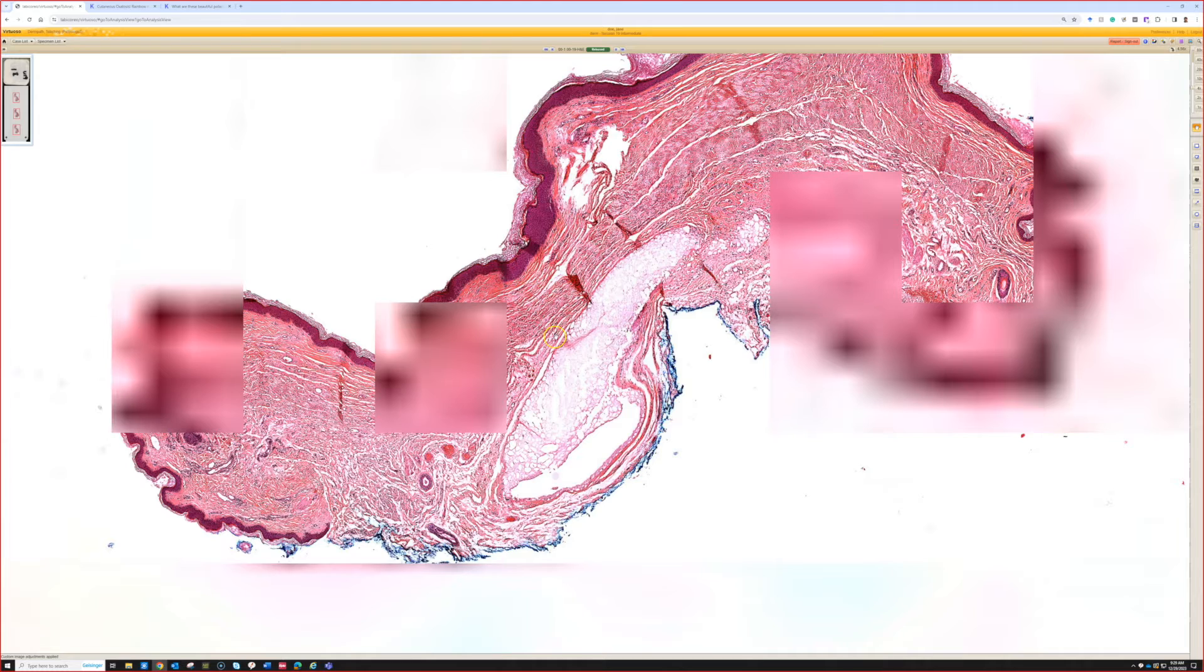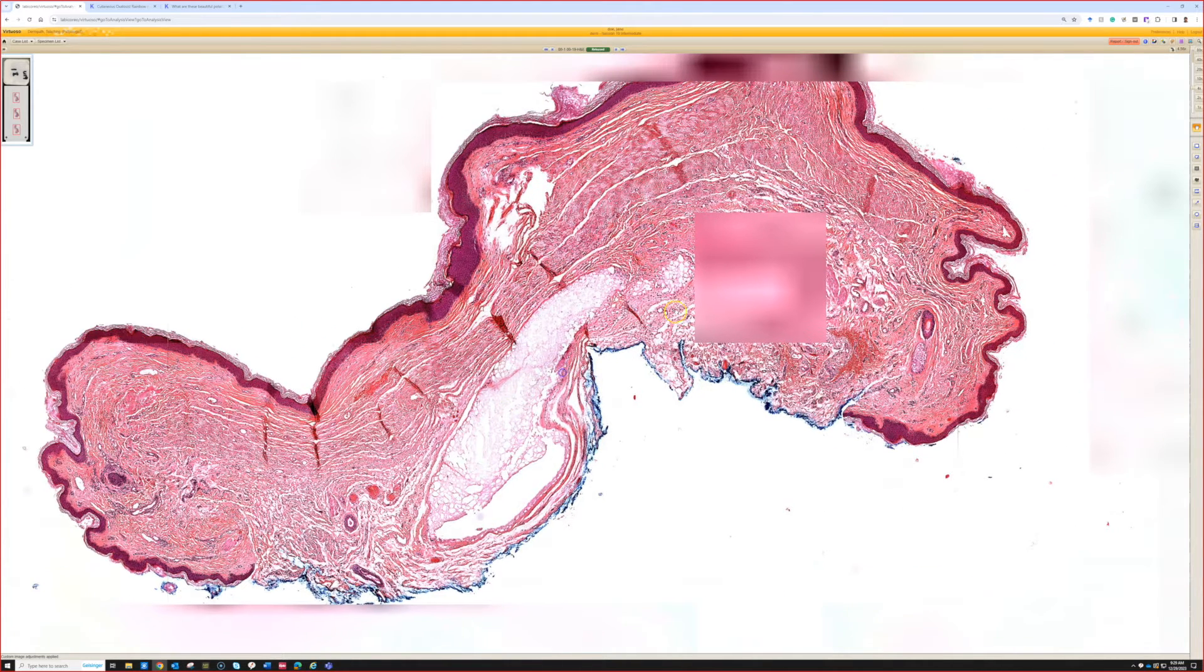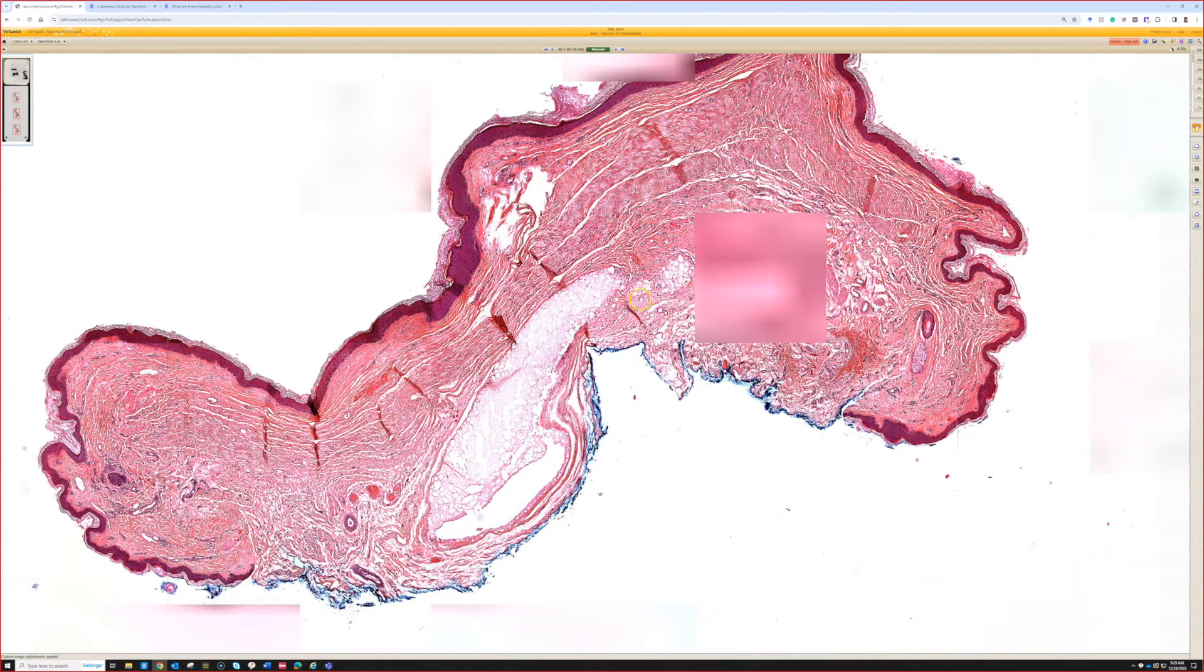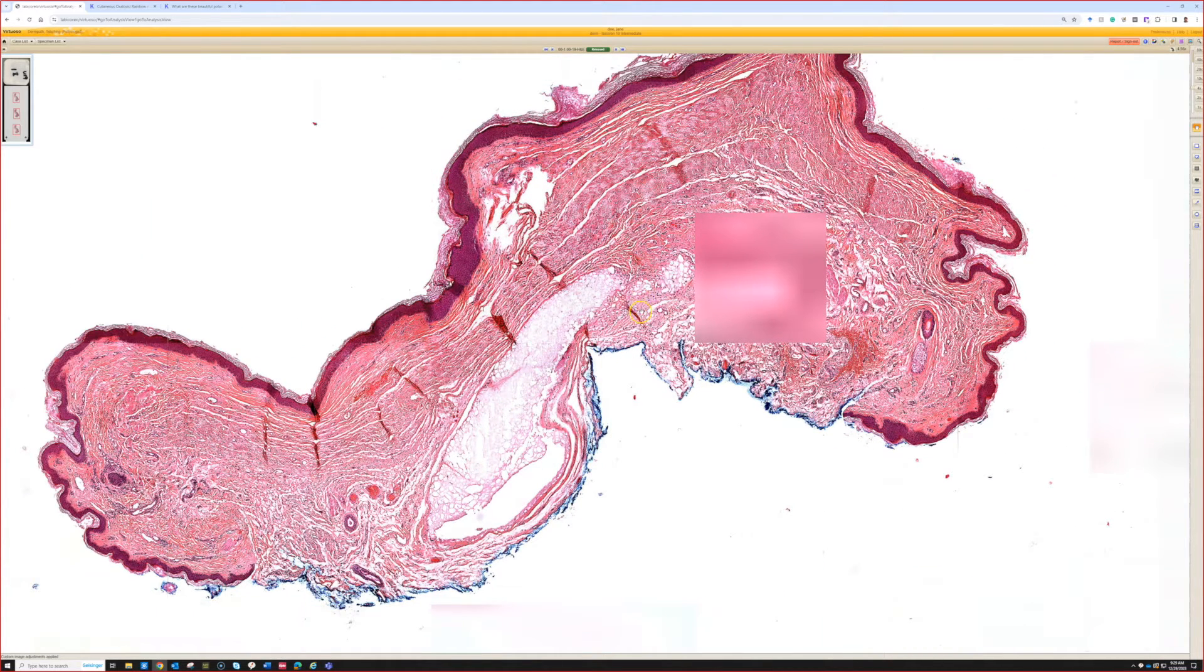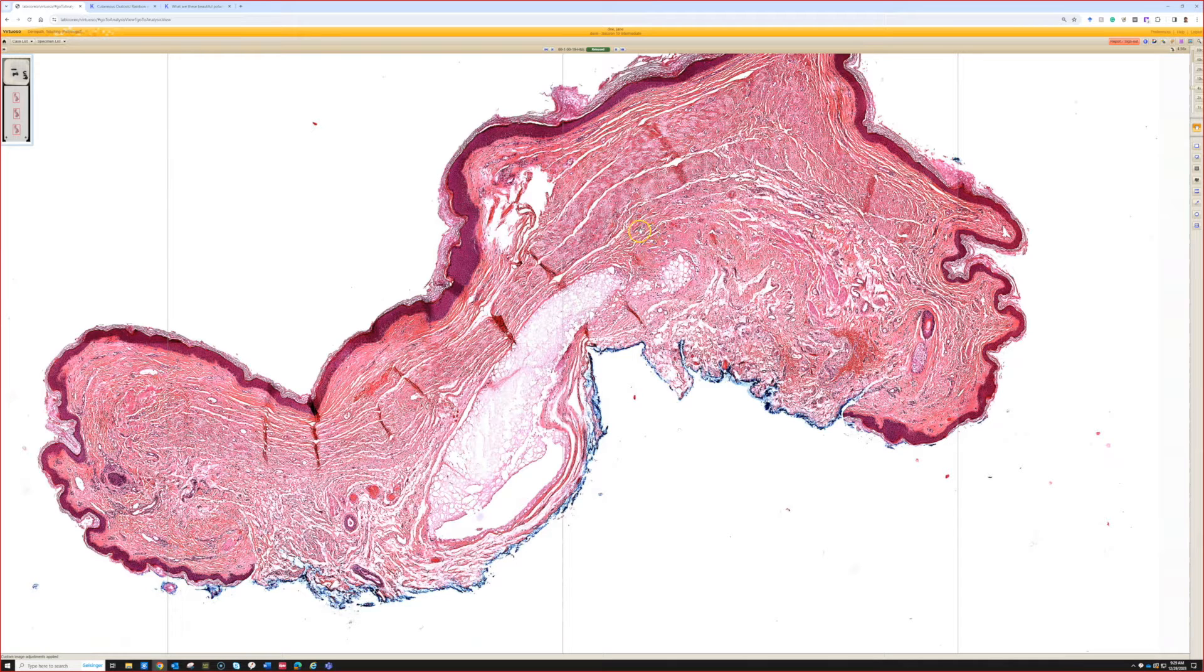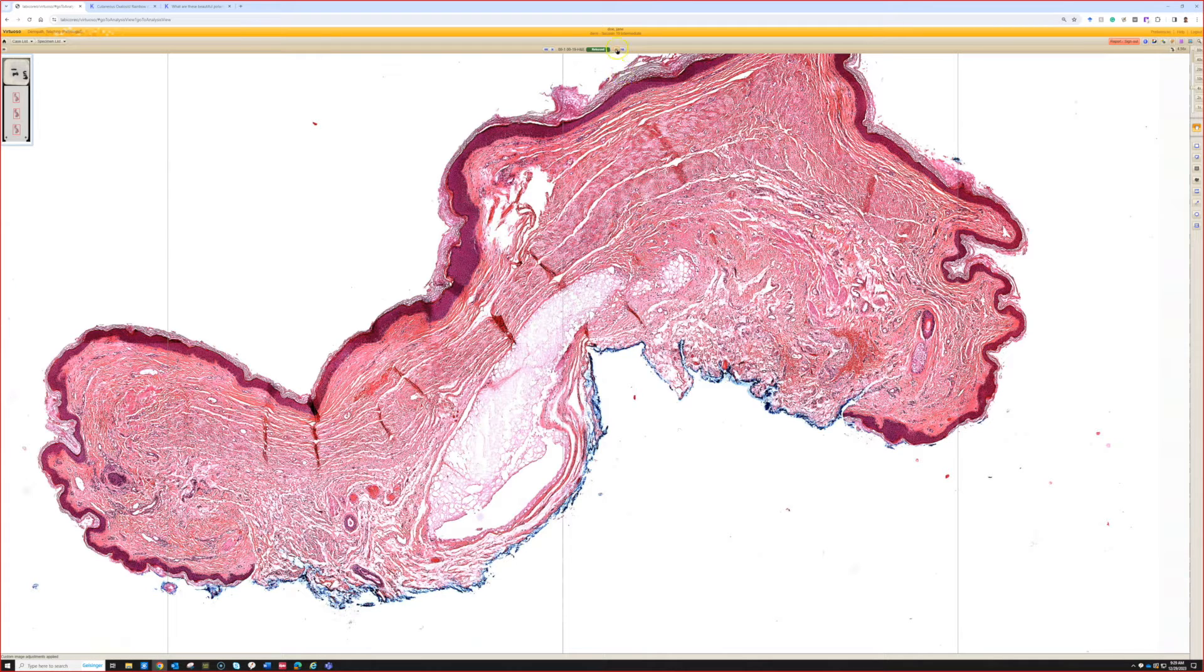So we just usually see this incidentally, but it's just important that when you see this, you recognize that's just injected steroid and it's not anything else. All right. Good job.